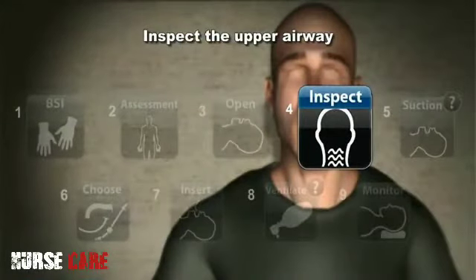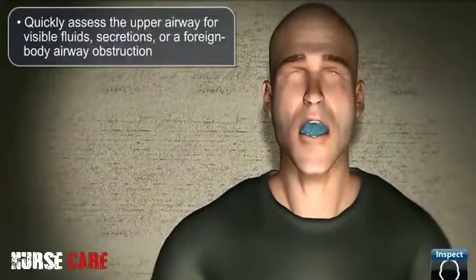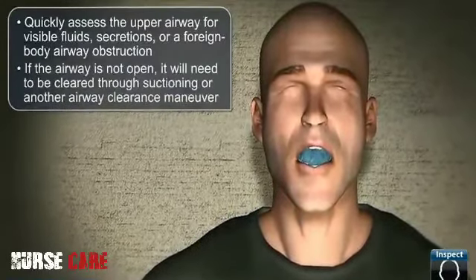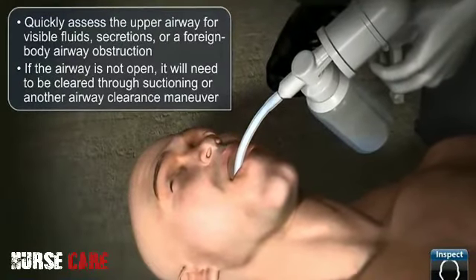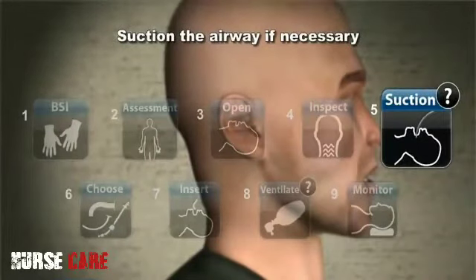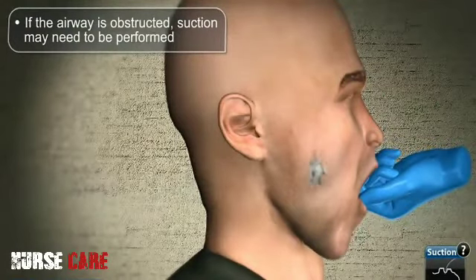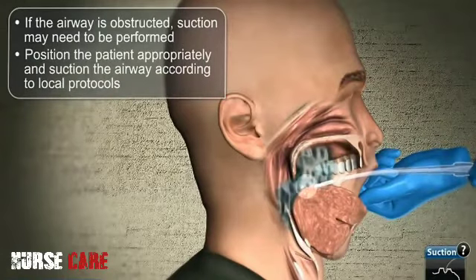Inspect the upper airway. Quickly assess the upper airway for visible fluids, secretions, or a foreign body airway obstruction. If the airway is not open, it will need to be cleared through suctioning or another airway clearance maneuver. Suction the airway if necessary. If the airway is obstructed, suction may need to be performed. Position the patient appropriately and suction the airway according to local protocols.